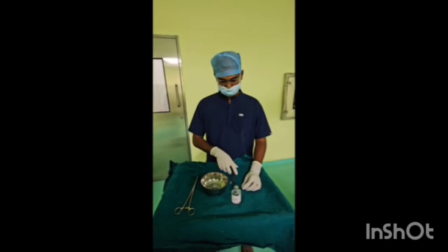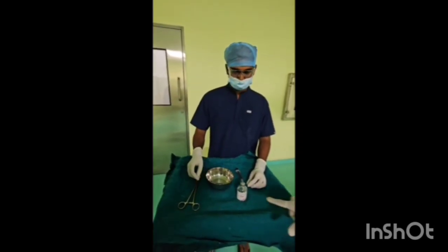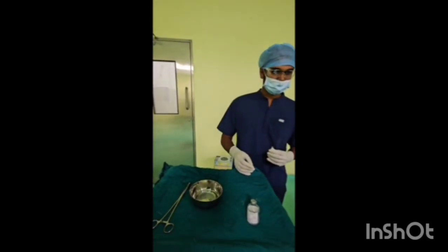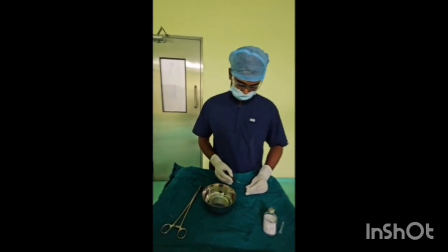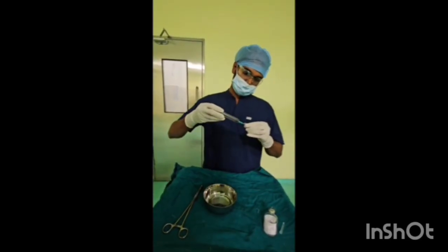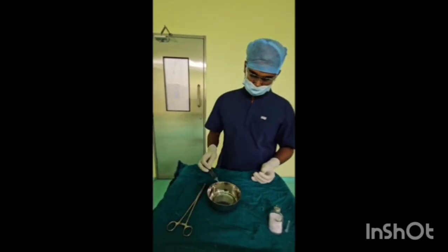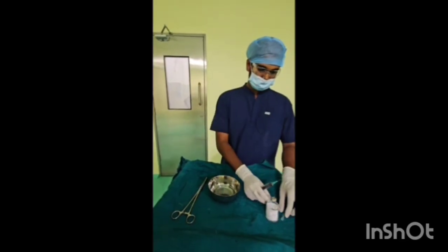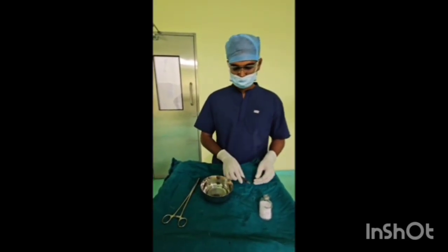So the anesthetist who is not involved in the study is preparing the drug for the block. The drug is being prepared and the solution is ready.